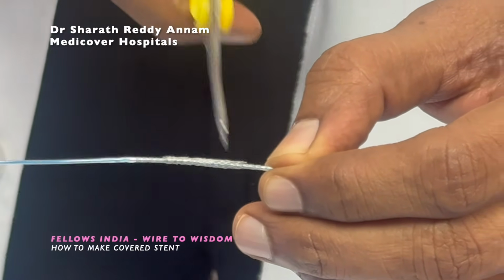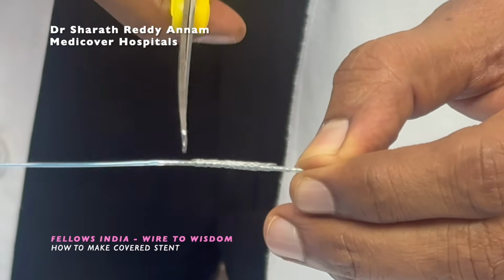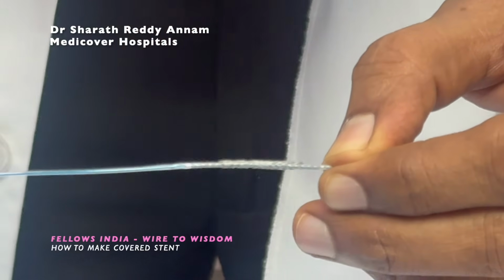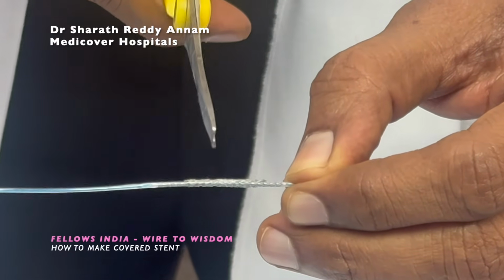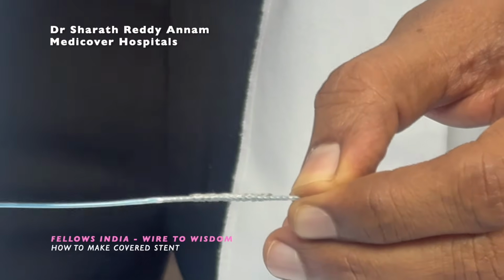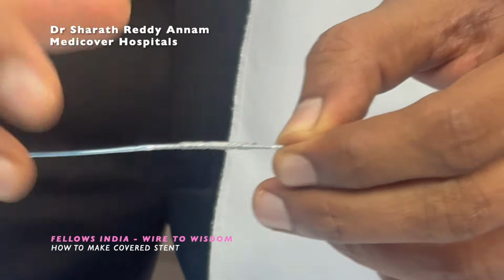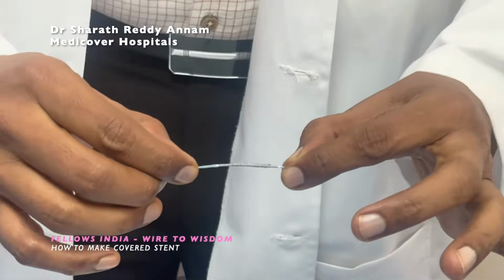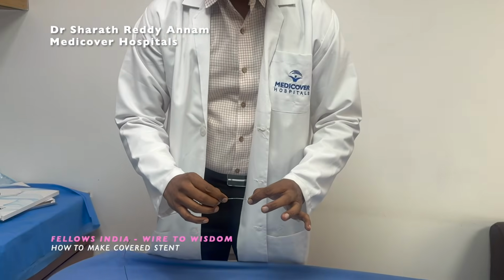This is something you have to keep in mind. Here the outer is 16mm, the inner is 28mm. Your perforation should be covered by the outer stent, that is the shorter stent. So you cover the perforation with the shorter stent and just deploy.